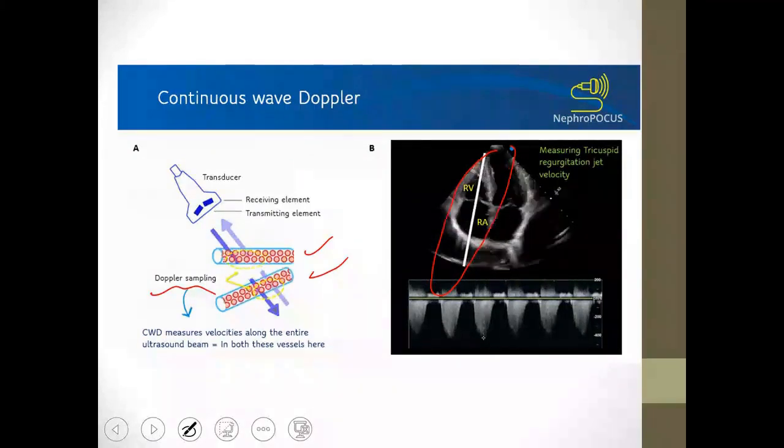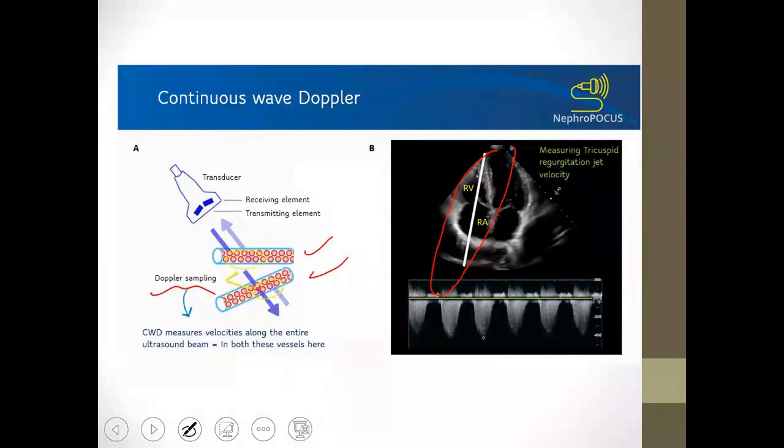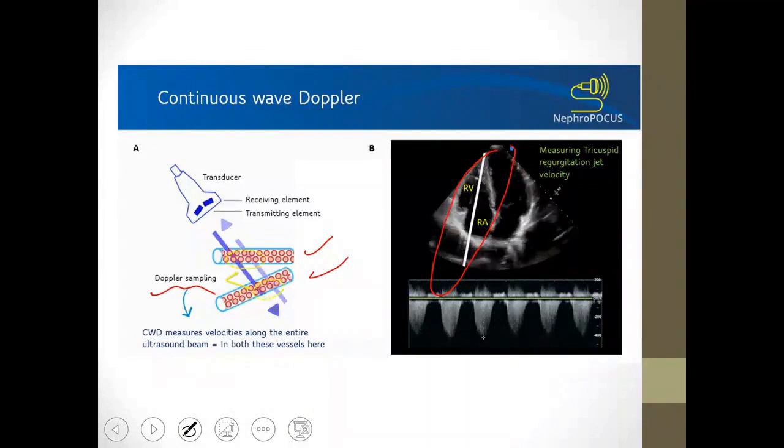If I use the continuous wave, for example, are any of you currently working with Echo? The continuous Doppler is what is used with the handheld Doppler, meaning that when we hear about it in emergencies, or when the specialist uses the handheld Doppler, they just listen to the sound, and it doesn't give them an estimation of the velocity. It only indicates whether there is flow or not.